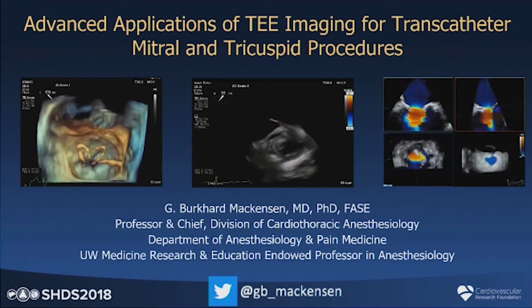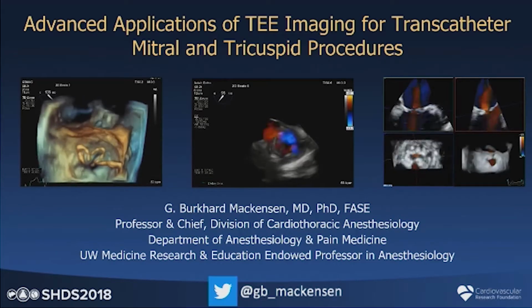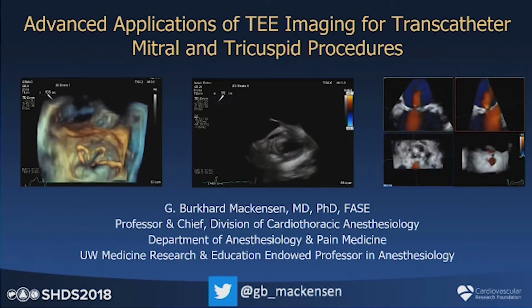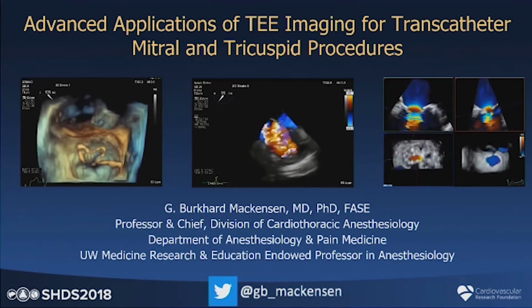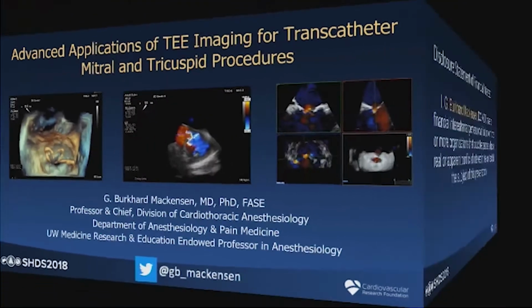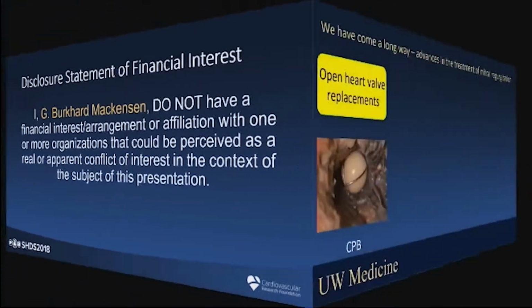Thank you very much for the invitation to speak at this panel. I'm going to try to use the next 10 minutes to give you a quick overview and a few highlights of how imaging has evolved from an echocardiography point of view, using TEE for these procedures in both mitral and tricuspid valves. I have no disclosures relevant for the talk.